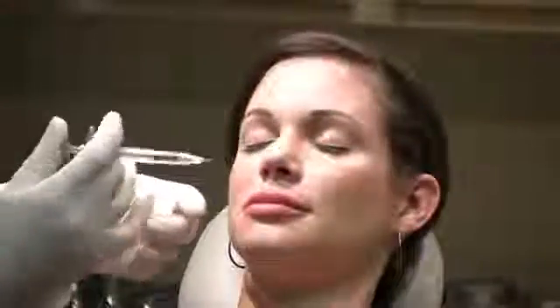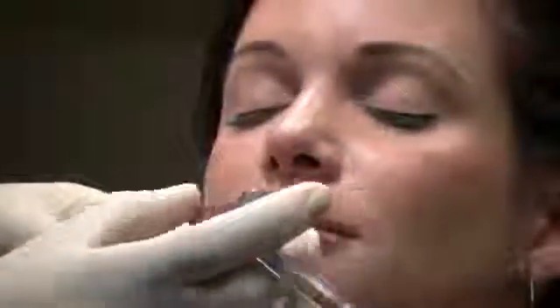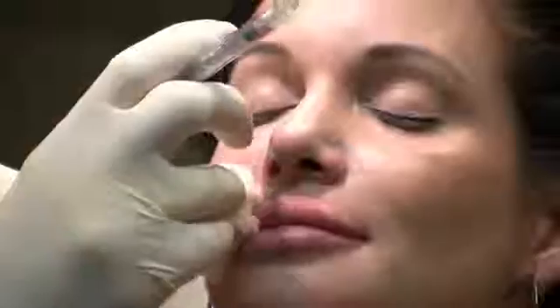What I did is I changed the needle to a fresh needle. It's sharp, and it also doesn't have the bacteria from the lips on it. And what I do is I again penetrate straight in to the high nasolabial fold. And this technique is different than the filling technique of the lips. And I use both to basically push up and volumize the tissue.